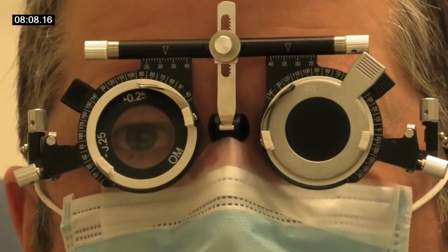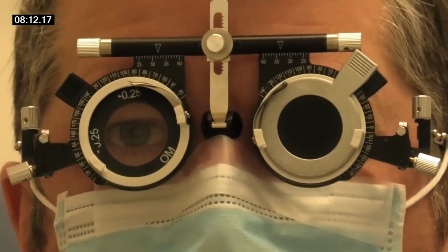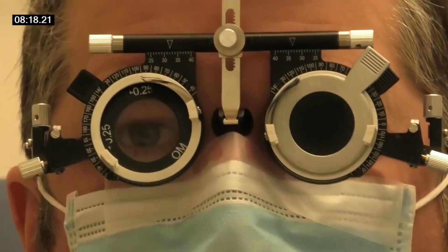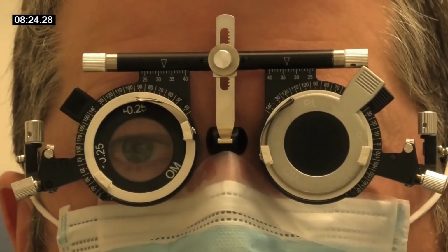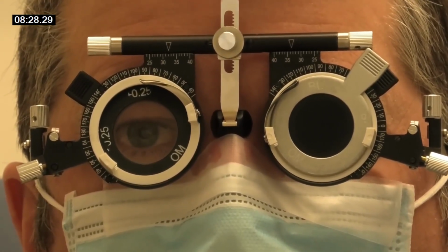And what is the smallest line that you can read now? Still at the bottom. Same. Yeah. So that's right. So now we're going to do the cross cylinder. So I'm going to change the. But because he's got quite good vision, hasn't he? We don't expect too much, do we? No. That's right. Little hints there I'm giving her. Remember that bit?